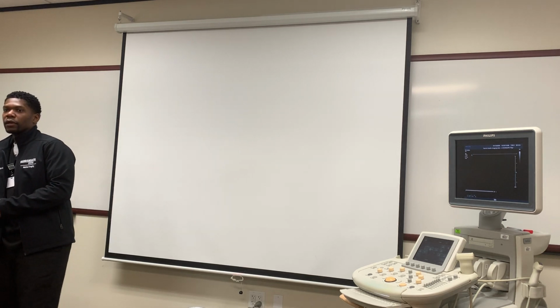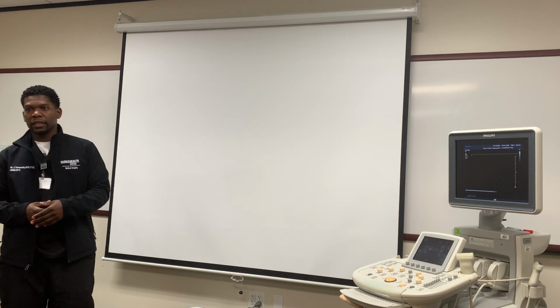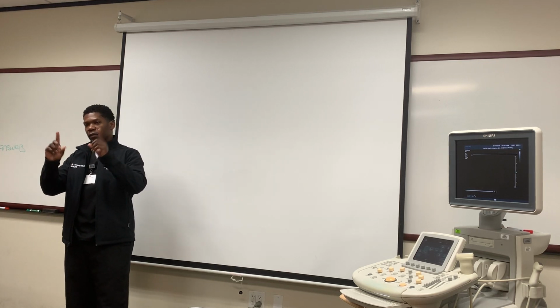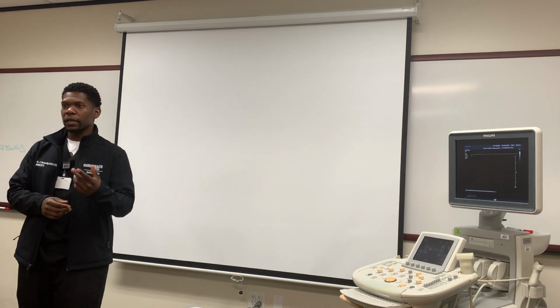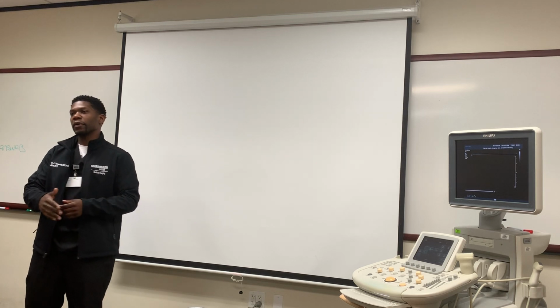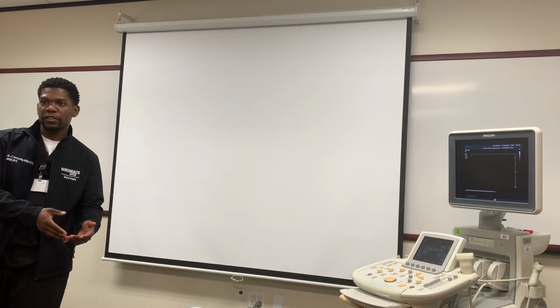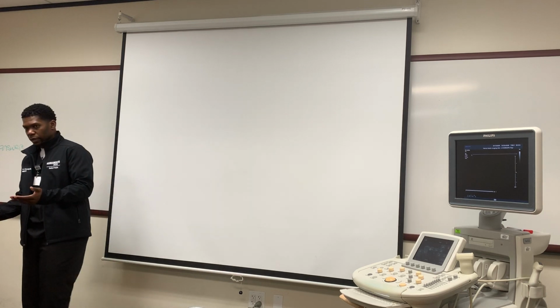Alrighty. Then we got to talk about frame rate first, because temporal resolution is determined by the frame rate. Okay? Remember, they have that direct relationship. So if our frame rate goes up, the number of frames per second goes up, that means our temporal resolution is going to be better. The more images we can create per second, the better our temporal resolution is going to be. So that's determined by the actual frame rate itself. Okay. Temporal resolution is what, guys?